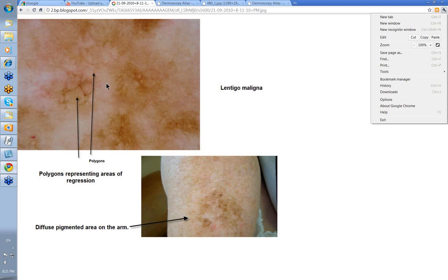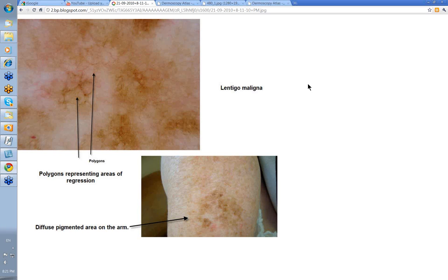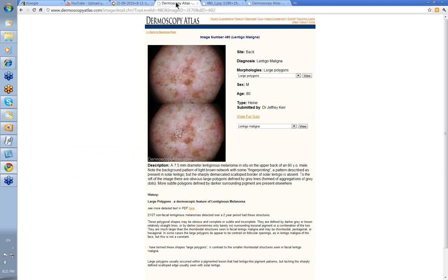This is what Jeff feels are regression structures. Let me just take you to the Dermoscopy Atlas where he first put this case up. This is his case of lentigo maligna with large polygons - a 7.5 mm diameter lentiginous melanoma on the back of an 80-year-old male. He's commented on the background pattern of light brown network with some fingerprinting pattern described as present in solar lentigo.